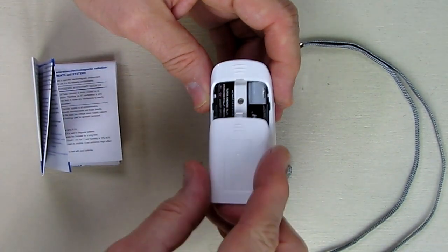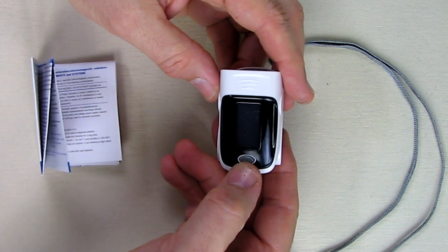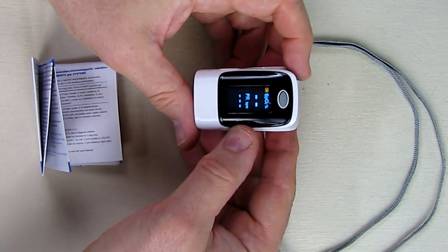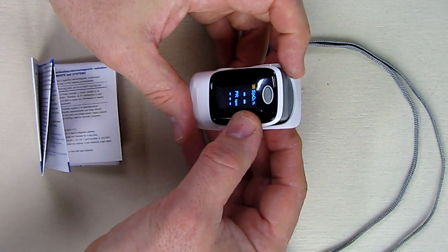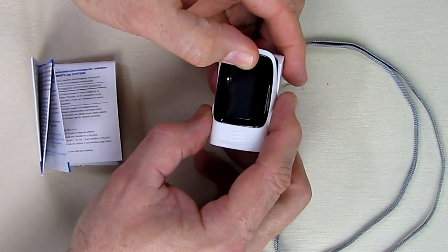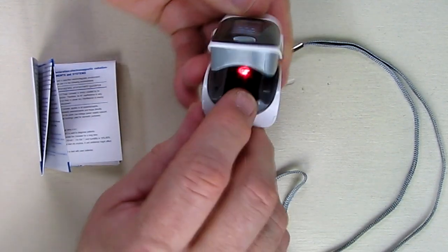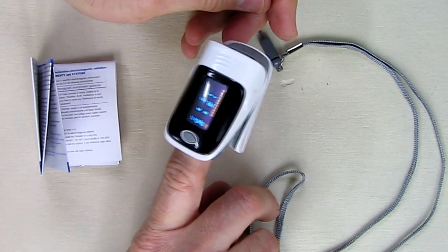Put the cover back on and slide it — it locks in place. There's a button here; we're going to turn it on by holding it down for a couple seconds and it displays the oximeter. Let's open this up and put my finger in. If you look closely you can see a red LED right there, and that's where I'm going to place my finger to get a reading.